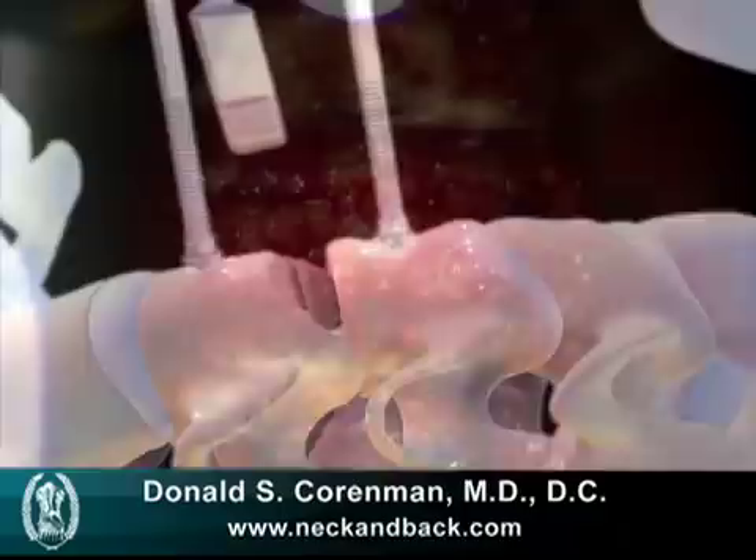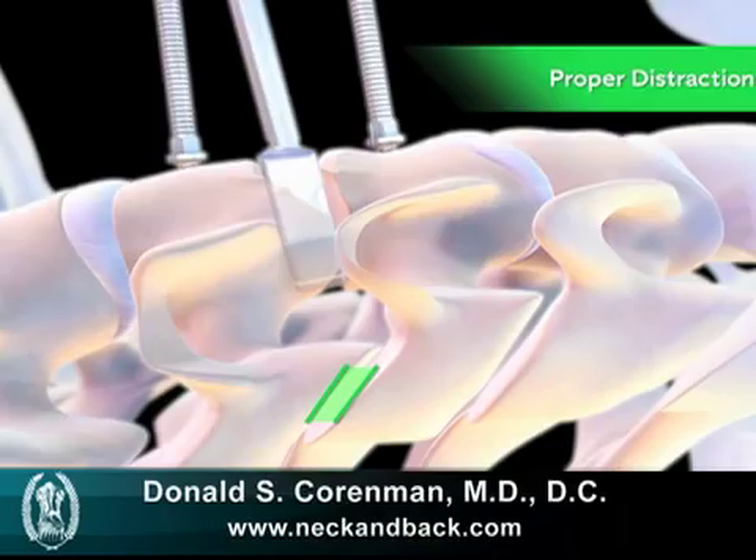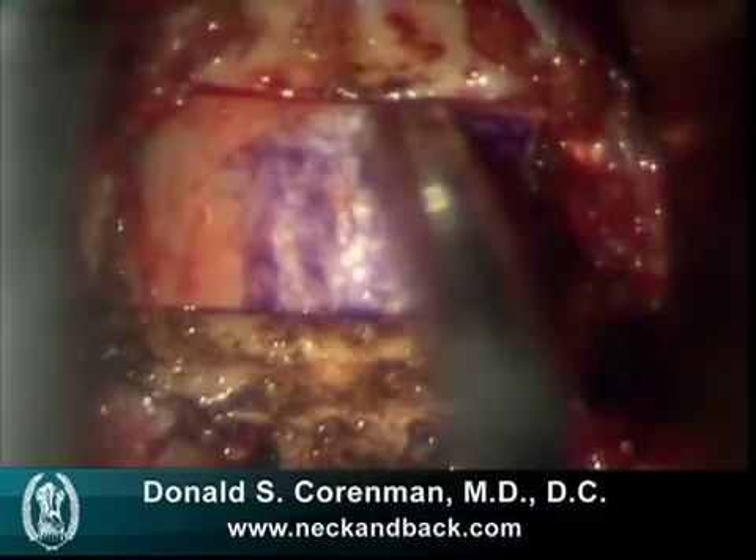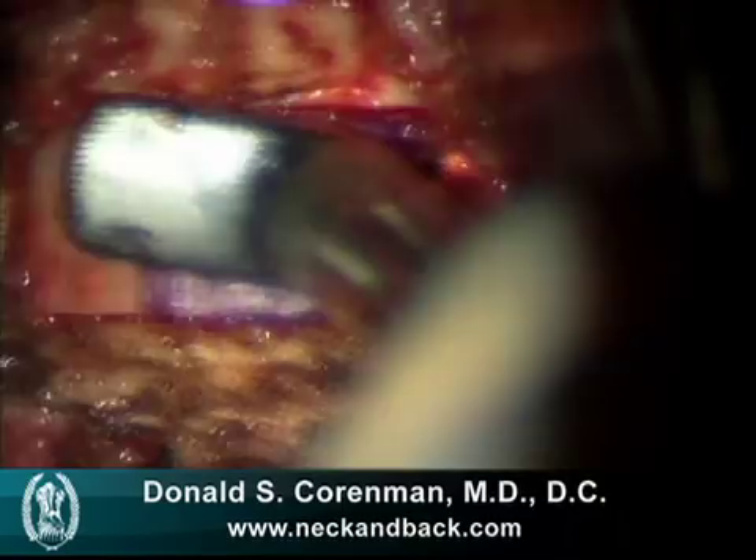Here we see a graft with a little purple on it — I actually dye the front of the graft purple to keep a good orientation on it, and we place it within the disk space. That was the initial impaction, then we do our final impaction, and this is how a graft should look. It should be perfectly interdigitated between the two vertebra and fit quite nicely, as you see.